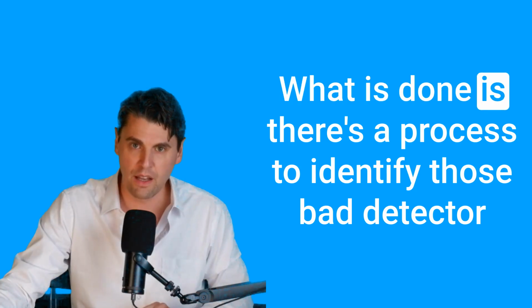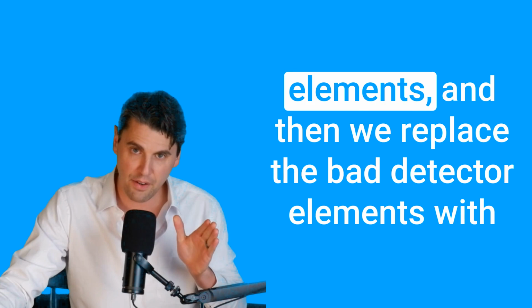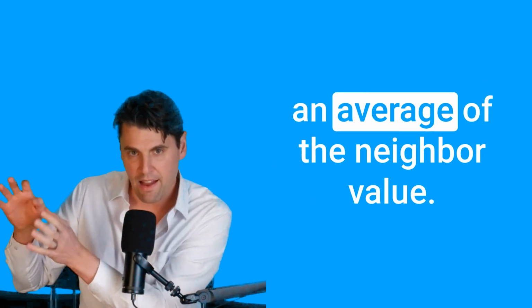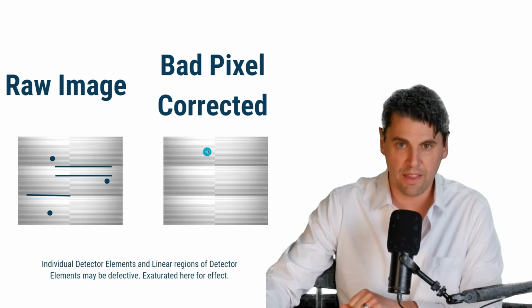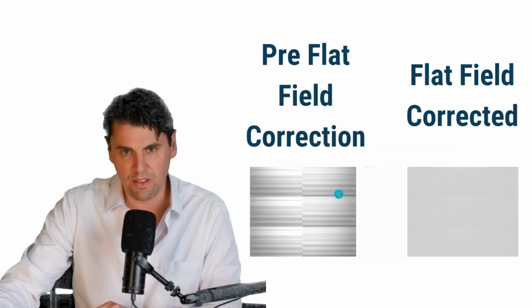What is done is there's a process to identify those bad detector elements, and then we replace the bad detector elements with an average of the neighbor value. That's what's called interpolation. So we can go from the raw image to an image that looks like this after that bad pixel correction. Then we still have an image that looks like this.